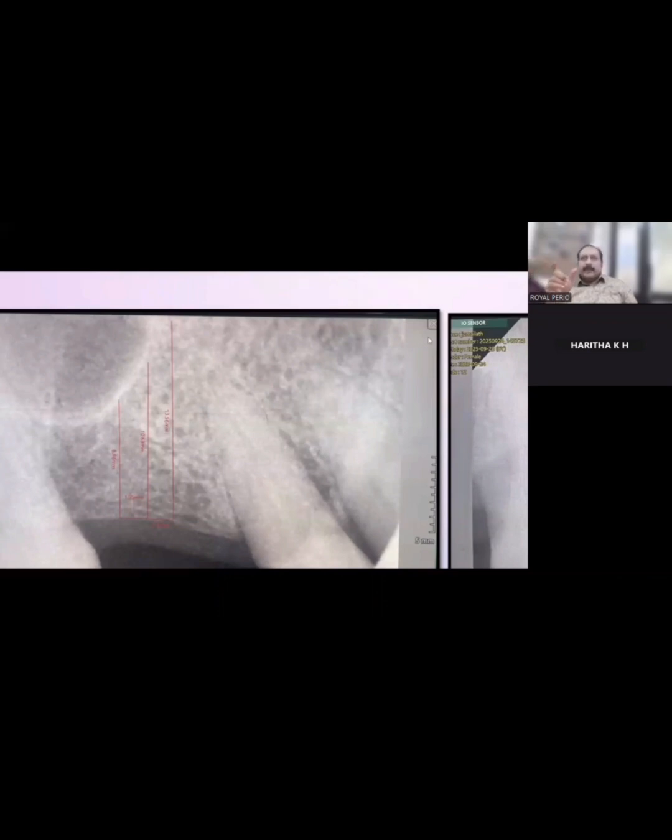So the entire width that you have shown there, how many millimeters distance are these 3 lines? What is that length you have taken down? 2 millimeter. Total of 2 millimeters. So it's 2 millimeters apart.